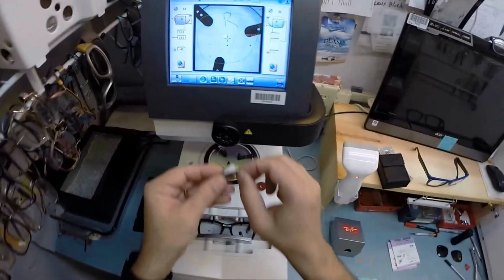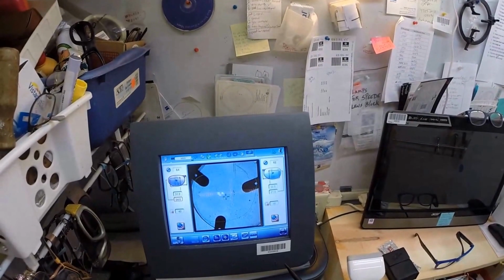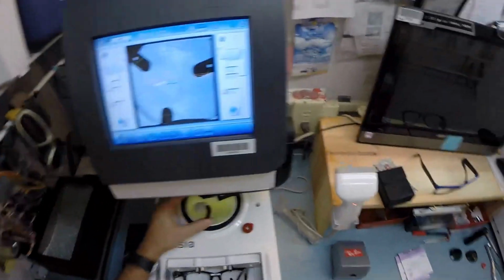So I'm going to pull the paper away to make, again, the black side sticky. Place that into the arm, and let's see, here's my stylus. I'm going to line up those optical centers, that dot right there, hit the button, the arm's going to come down and place the block onto the right lens.